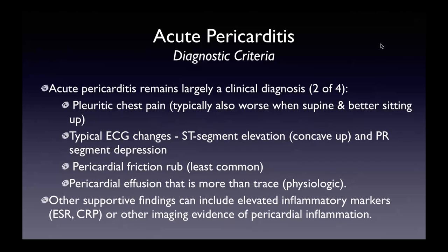The other thing about the ST elevation, as many clinicians know, is that it's usually fairly diffuse, multiple leads crossing multiple coronary territories. You can have actually localized pericarditis where it tends to be a bit more regional, and then it gets to be a bit confusing with regards to ST segment elevation myocardial infarction versus acute pericarditis.